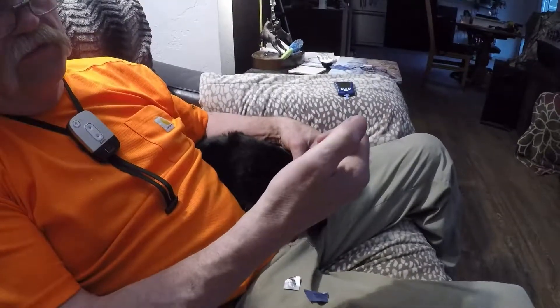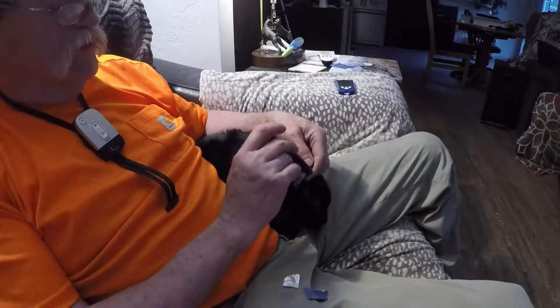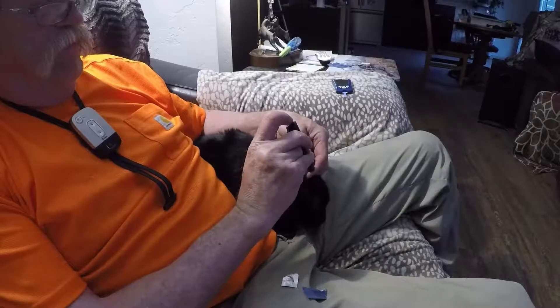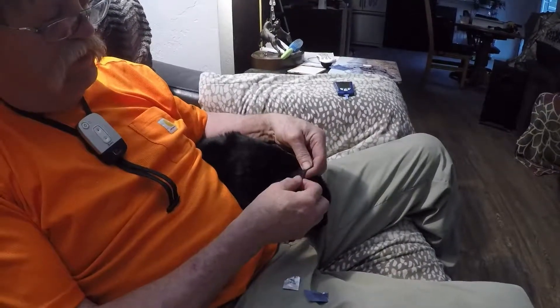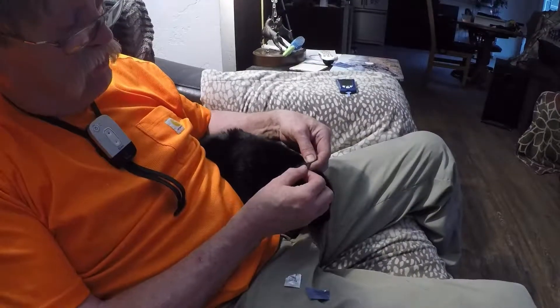Then cock the plunger. Find the area you want — go close to the edge. There's a vein that runs along the edge of the ear that you want to hit, and just click it. It goes through. I hold the ear so it doesn't shake his head and the blood go away.